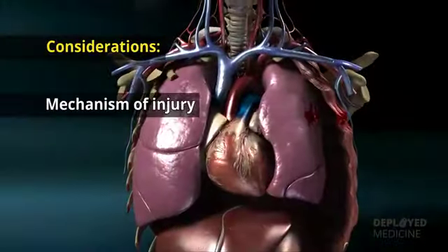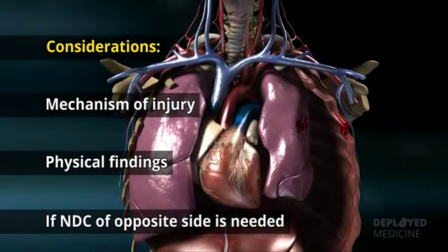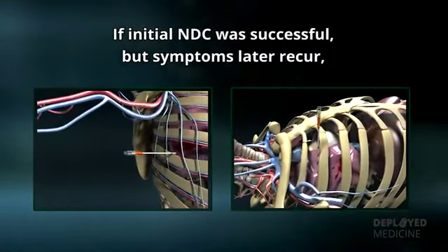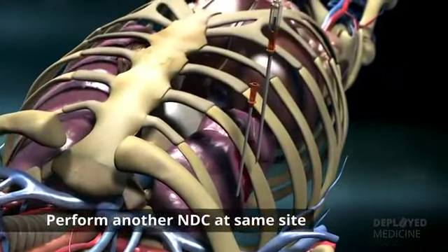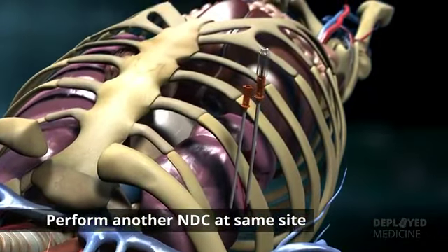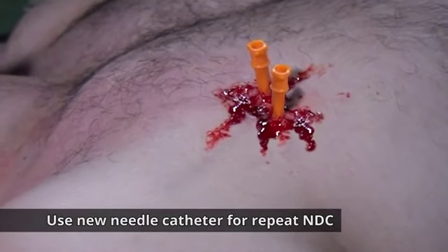Consider, based on the mechanism of injury and physical findings, whether decompression of the opposite side of the chest may be needed. If the initial NDC was successful but symptoms later recur, perform another NDC at the same site that was used previously. Use a new needle catheter unit for the repeat NDC.